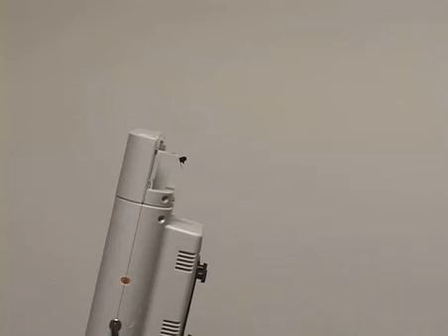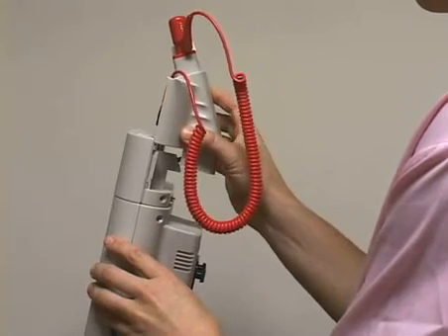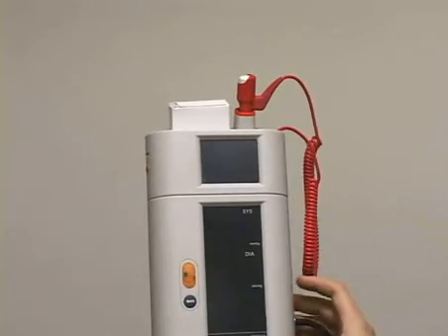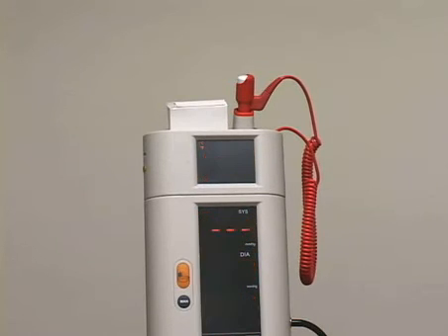To take a temperature measurement with a rectal thermometer, remove the oral axillary unit and replace it with the rectal unit. The Suntec 247 will recognize the new unit and will beep when ready for use.